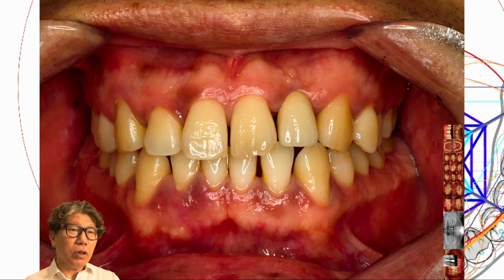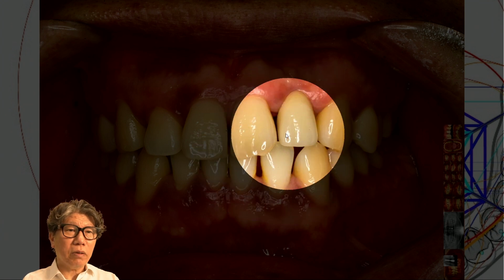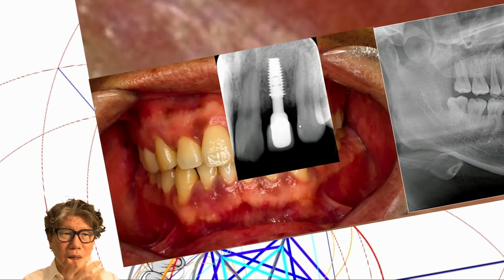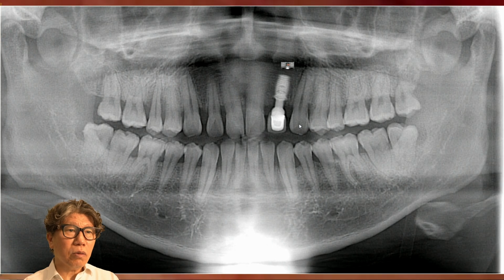So you see, there are cases like this as well. You will see now. This is an implant, but there is not much of an overbite. Then space was also created. So these cases make the implants last a long time, because it does not receive occlusal force. In fact, this patient has been using the implanted dental fixture for over 10 years without any issues.